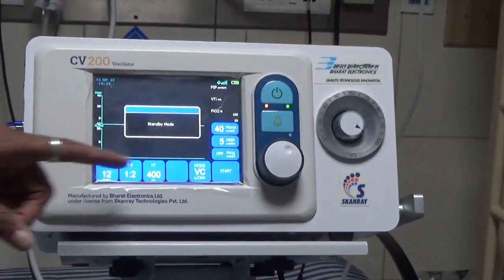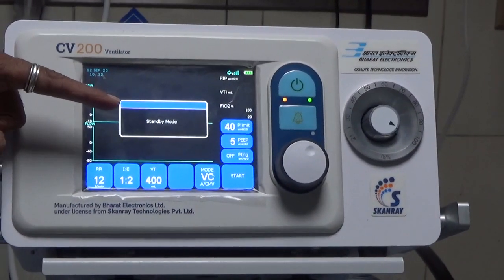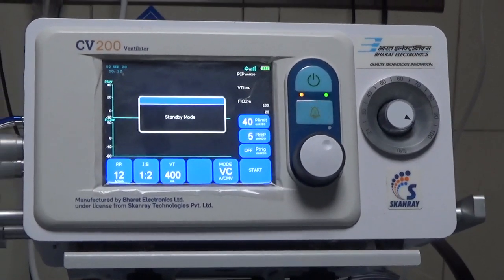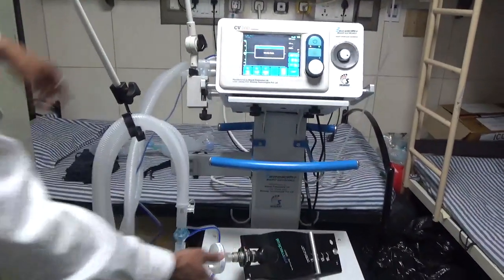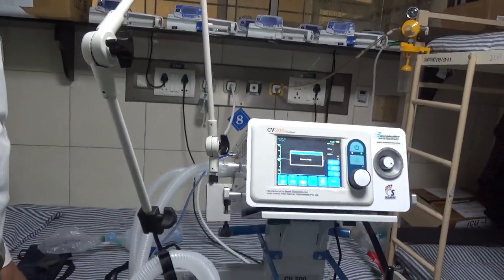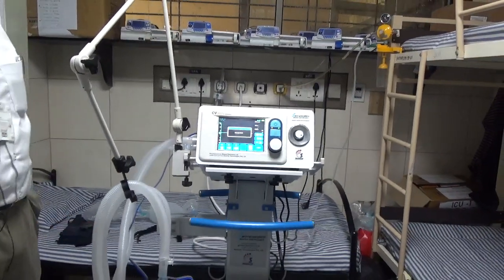The blue boxes you can see are the default settings, and you can see that in the middle of the screen it says standby mode. Now, what I have done is I have connected the circuit. You can see that in the circuit there is a filter at the patient end, and there is a filter at the end where the air goes out, ensuring that the patient and the air that comes out from the patient are both sterilized.